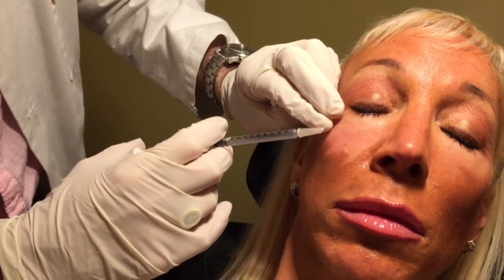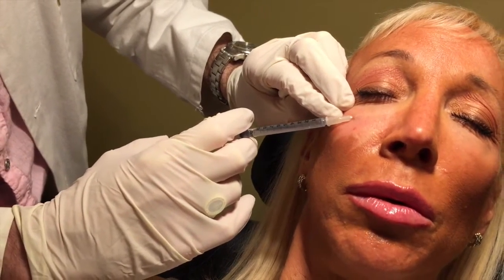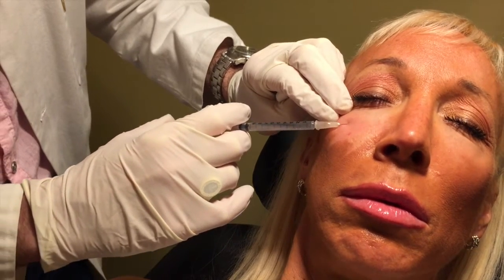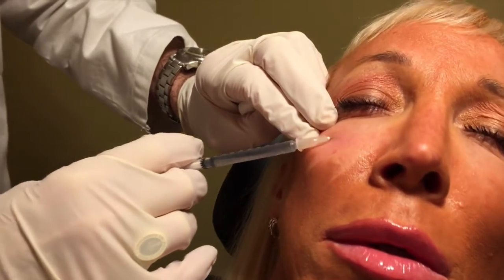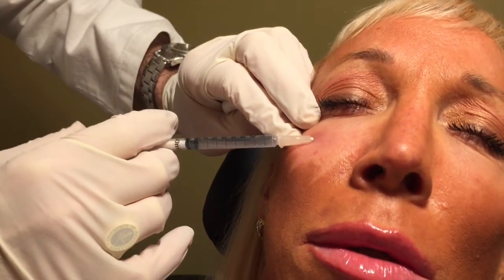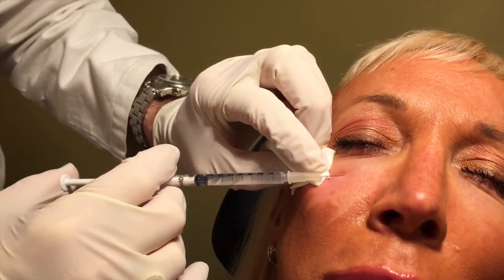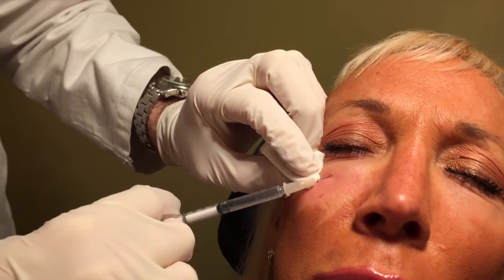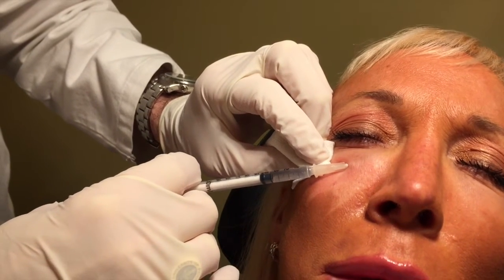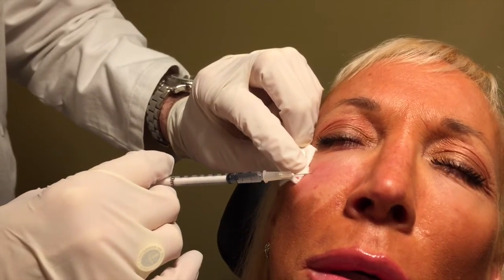Okay, just take a deep breath in for me, and then let it out. So almost the way sometimes you'll put in a filler, I'm doing sort of a little bit of a fan pattern here, and a little bit deep. And then one more here for the more medial part. Almost done here.